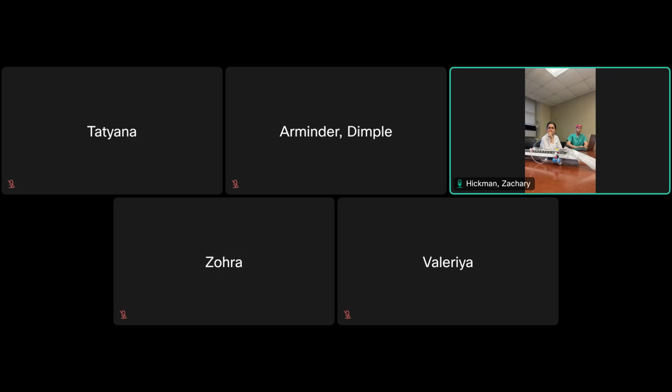You can do Frazier's and just go occipitally. What is it like? 6 and 4. Just kind of forward. So 6 up and 4 over. Yeah. And then I guess you just aim perpendicularly.